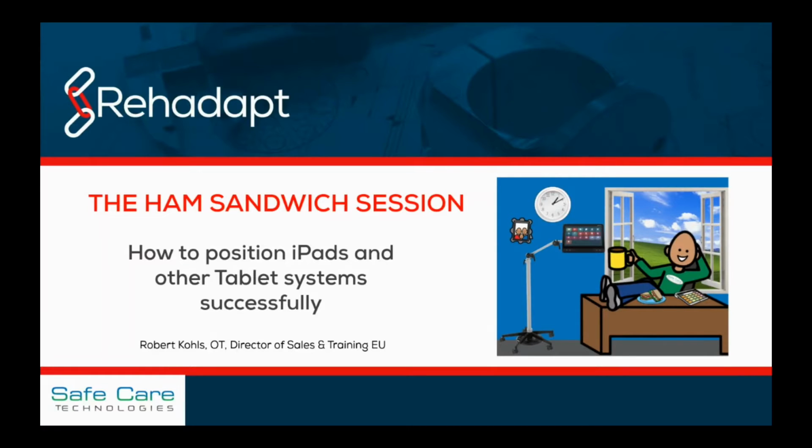We are producer and manufacturer of mounting solutions for AAC devices for different kind of situations for customers with individual needs and supporting demands. So as part of the ham sandwich sessions, I'm very proud to tell you today a little bit more about how to position iPads and other tablet systems successfully for different environments.